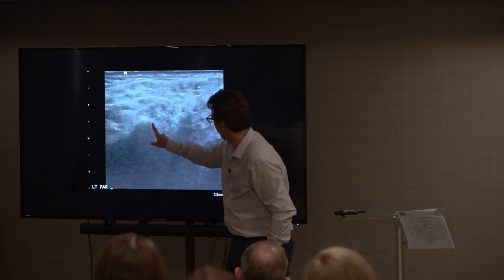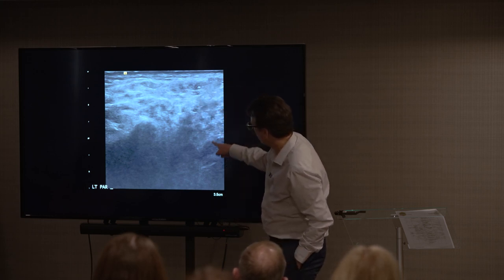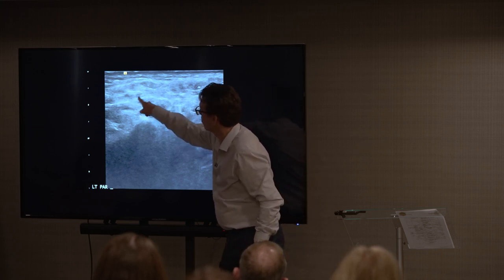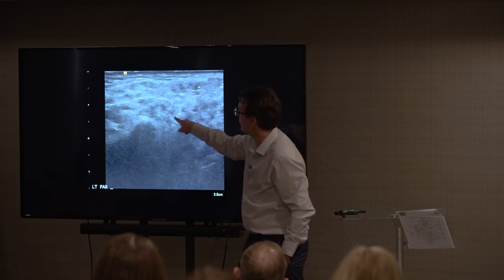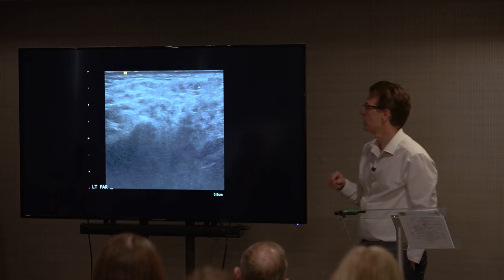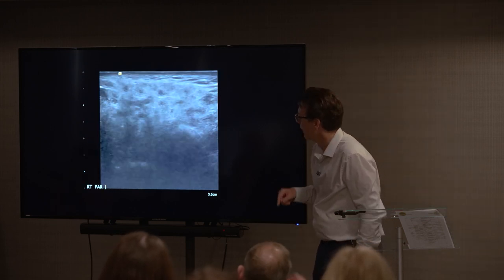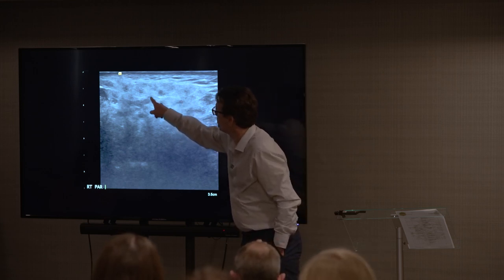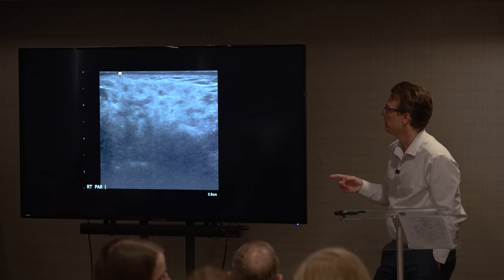To orientate you — the mandible is here, this is the parotid gland, and can you see all these little dark hypoechoic spots within it? This is what Sjögren's looks like on ultrasound. Again, similar on the next image — these dark spots in a patient with a confirmed Sjögren's diagnosis.